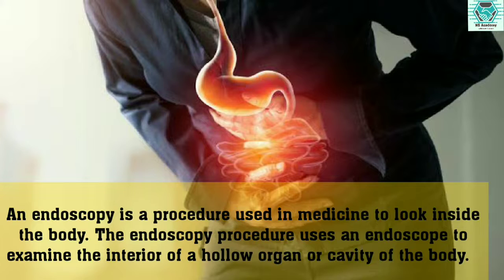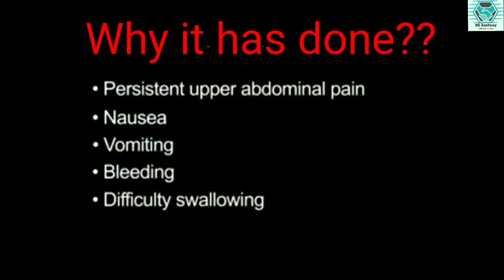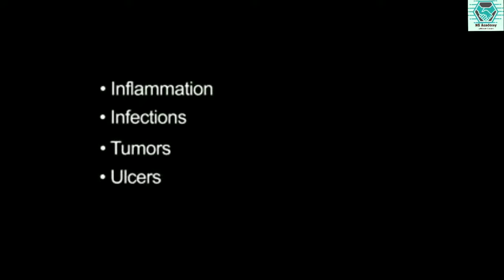So why is the endoscopy done? It helps to evaluate persistent upper abdominal pain, nausea, vomiting, bleeding, and difficulty in swallowing. It can detect inflammation, infection, tumors and ulcers.